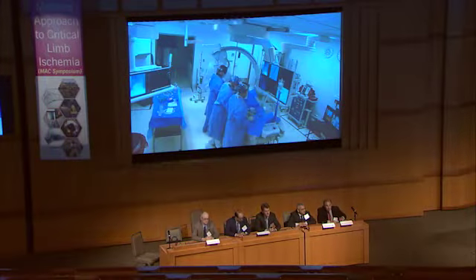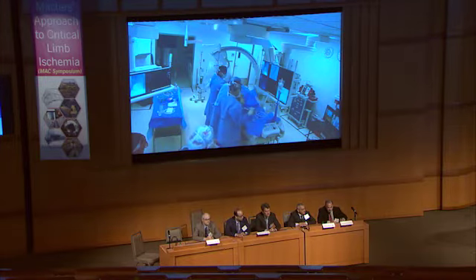Yeah, there's traction. The anatomy's different. The layout of the vessel is different. It's a little more difficult to traverse. You've done a great job so far. That's a very nice case.